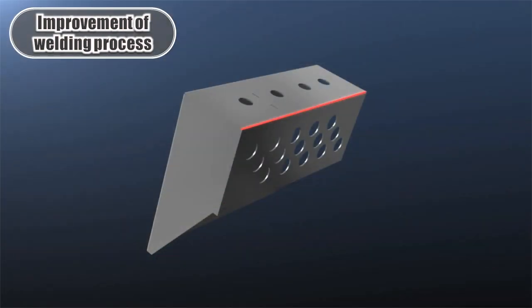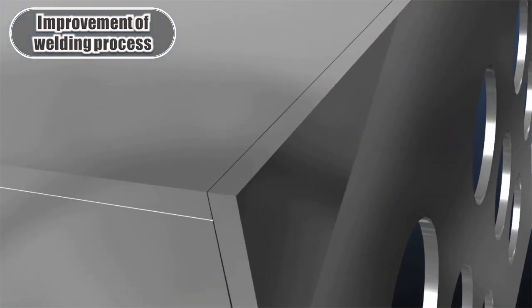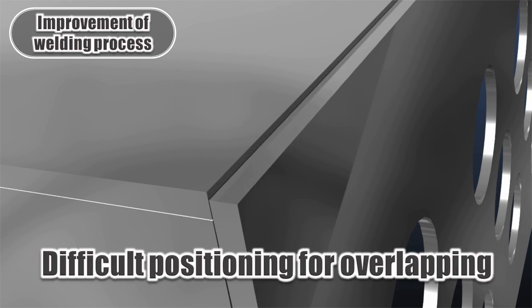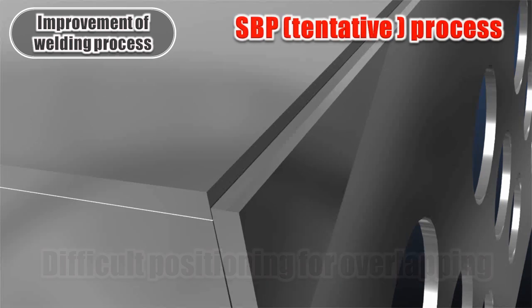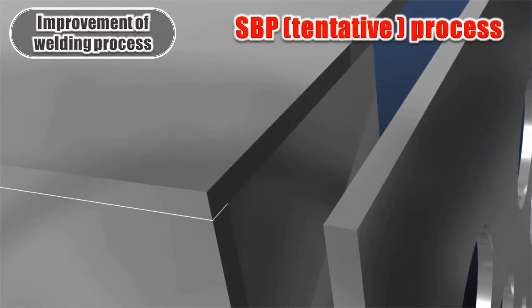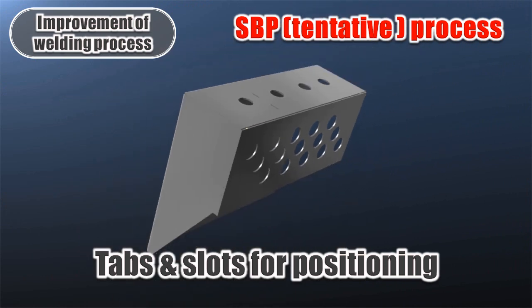When our shape is being welded, the sufficient 50-50 weld overlap is necessary, which is very difficult with positioning for overlapping. We would like to introduce you an effective way to position the welding overlap: the addition of tabs and slots that are half of the sheet thickness.